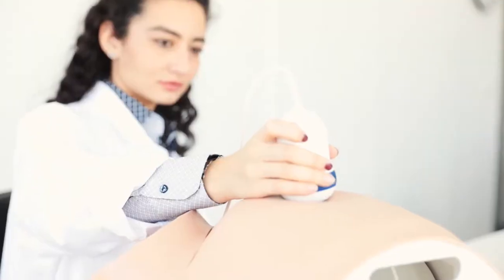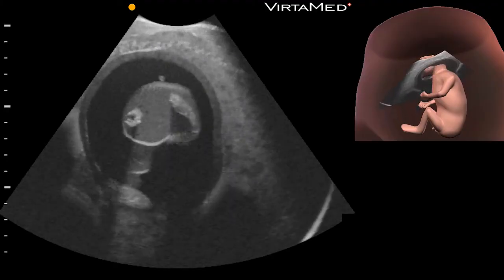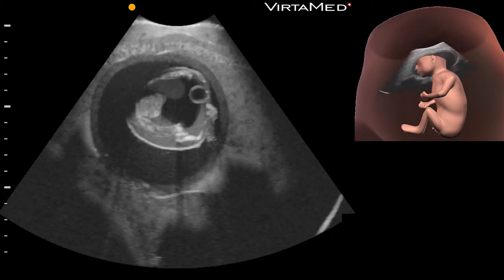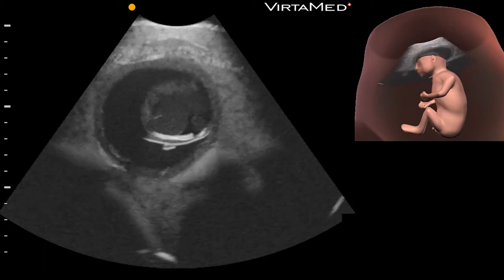Right now, the way that we teach ultrasound is by having trainees do ultrasounds. However, you need to do hundreds or thousands of ultrasounds, not only to feel comfortable with the procedure, but then to have the opportunity to see some abnormal cases. And I think simulation, apart from initially training somebody, which for ultrasound is relatively straightforward, the big benefit is going to be when you are able to use the simulator to actually teach ultrasound for pathologic findings that are relatively rare but very important for them to have the skills.